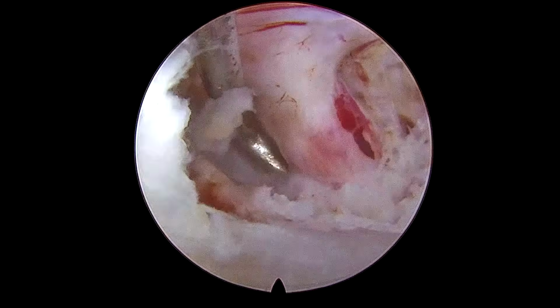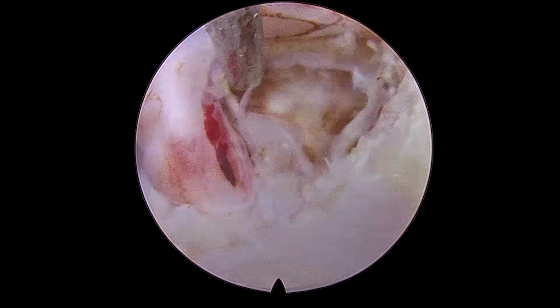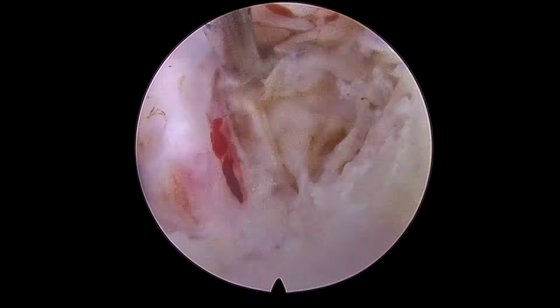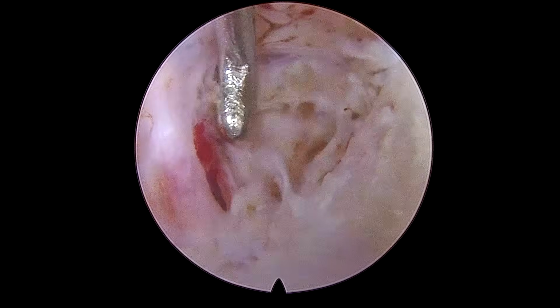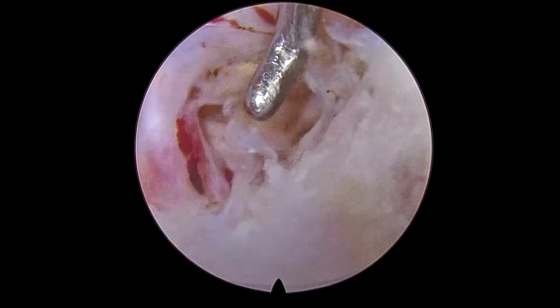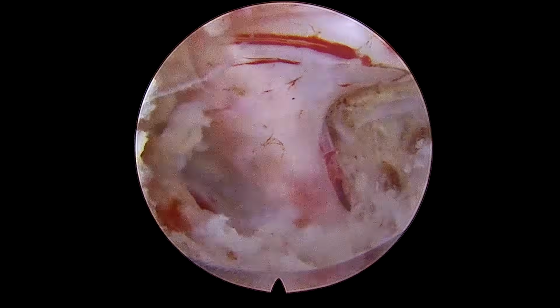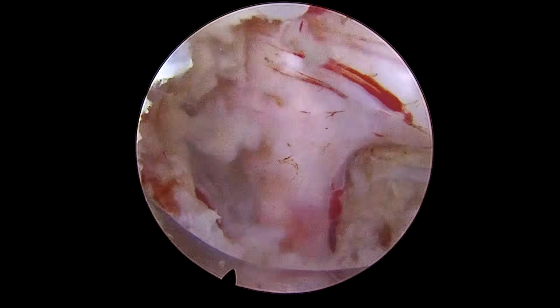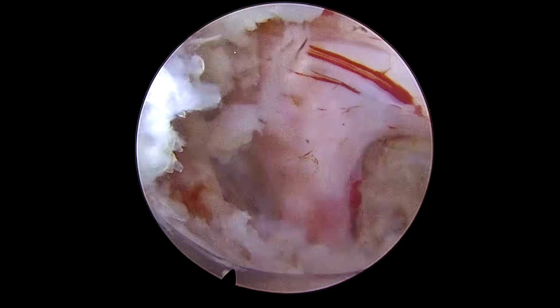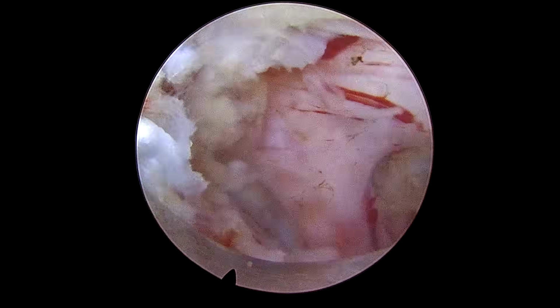Root looks lax to me. There is no fragment under the root and no fragment here as well. You can see there is an annular tear, but we are not going to touch that annular tear unnecessarily, at least. So I think we have done our job.